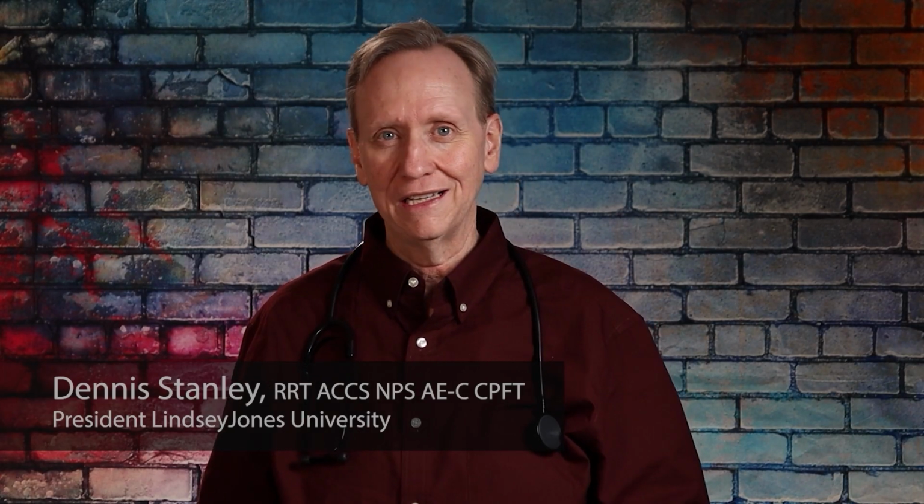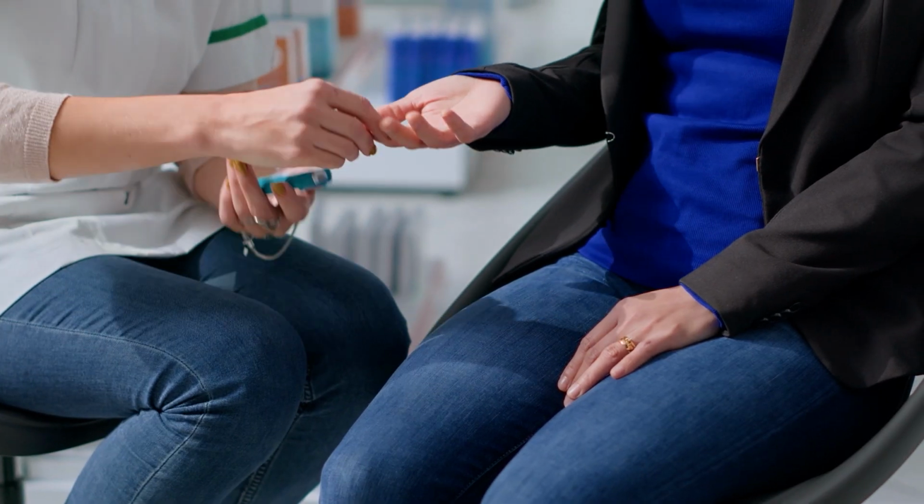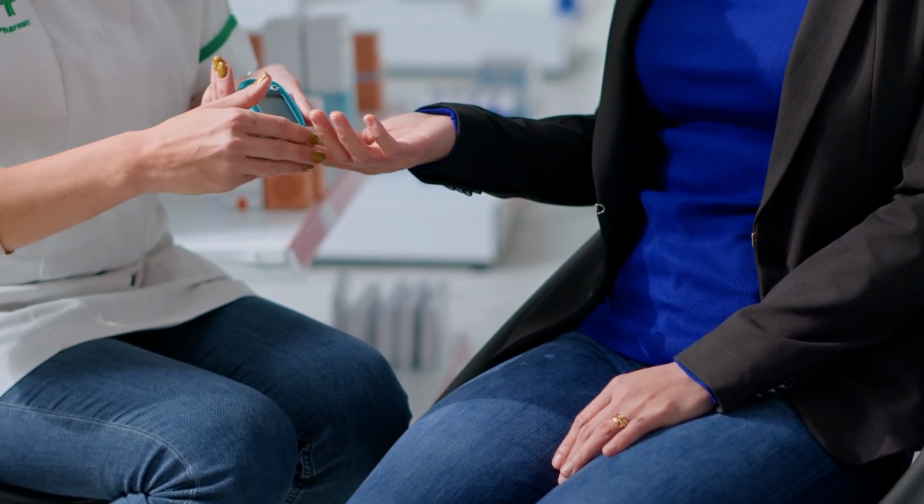Quality control is about checking these machines and these analyzers from time to time to make sure that they are working accurately. Now this applies to a broad range of machines and analyzers, including things at bedside like a glucose or a blood sugar monitor. We must do quality control on those.